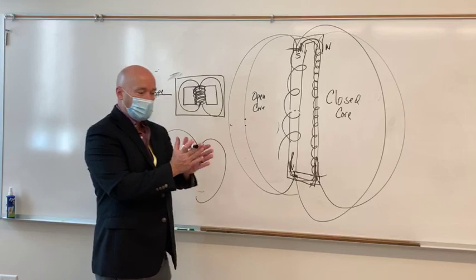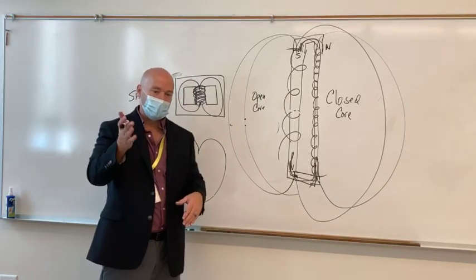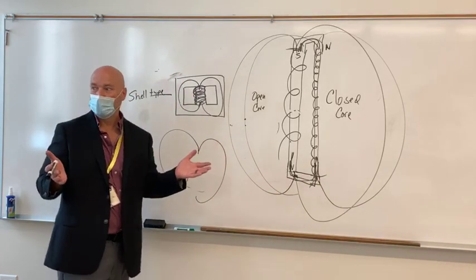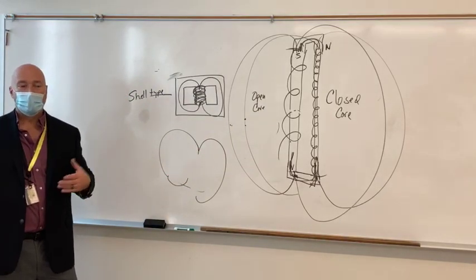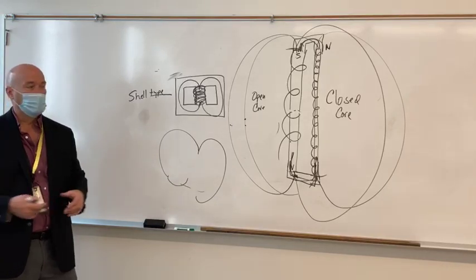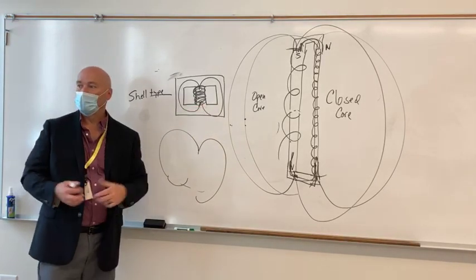If you look at the edge of a piece of plywood, plywood is laminated. So you got a good piece of wood on the front, a not so good piece of wood in the back, and scraps in between. That's lamination, essentially. And again, I'm not real sure how laminated cores are more helpful to get rid of some of those eddy currents. They just do.